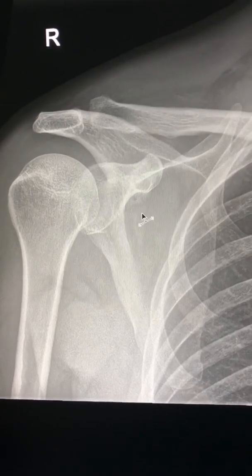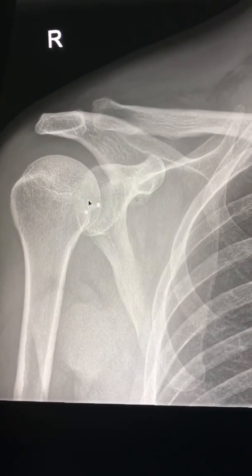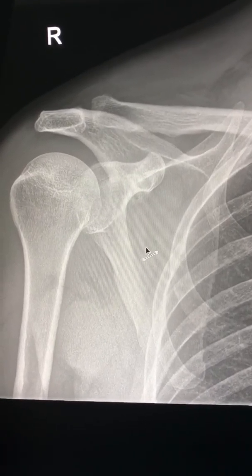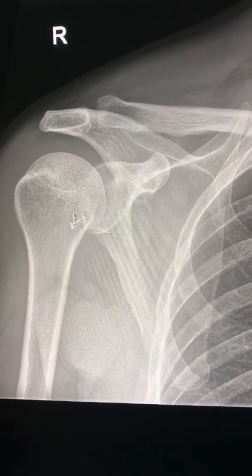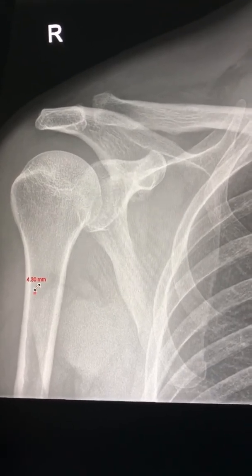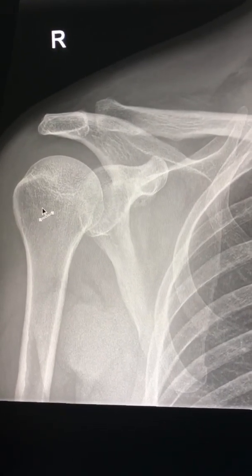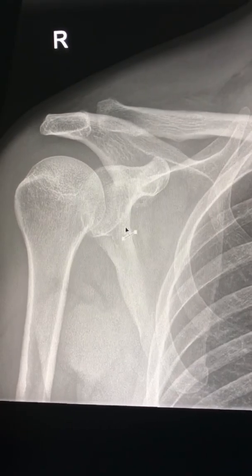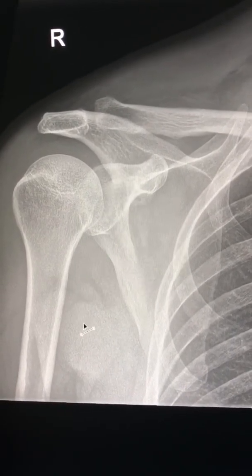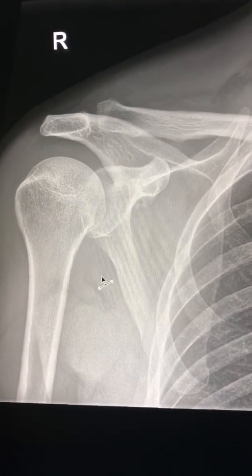Next, check the position of the humeral head. If it is lying under the coracoid, it means it is anteriorly dislocated. If the humeral head is in the shape of a light bulb, that is indicative of posterior dislocation. If the head is lying under the glenoid, it is indicative of inferior dislocation, which is very rare and present in only 0.5 percent of total shoulder dislocations.